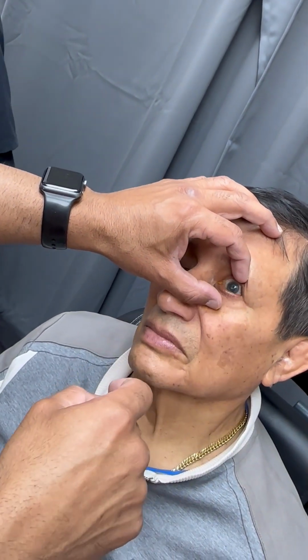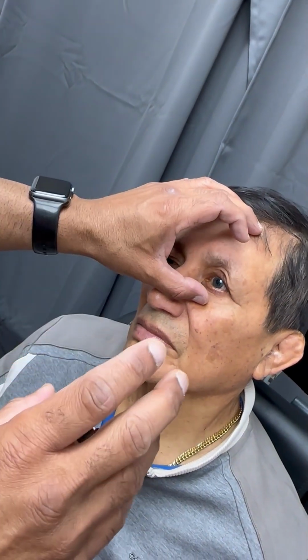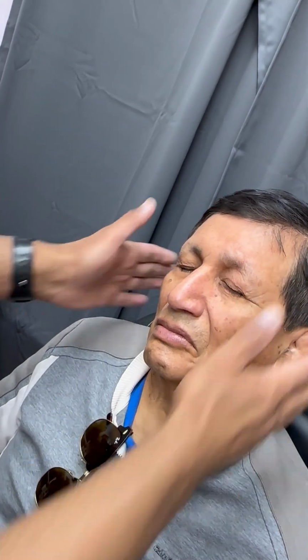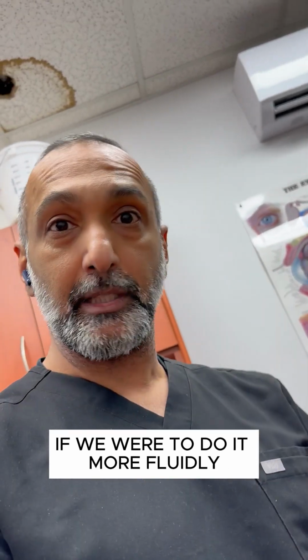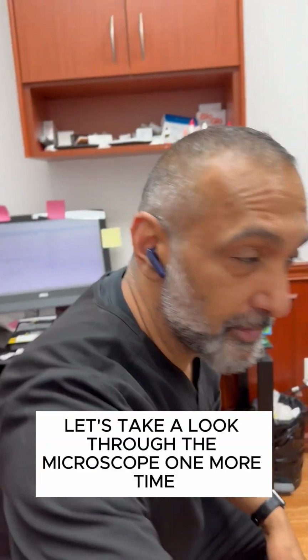Mira abajo el piso. Mira a mí. Good. Suavecito, cierre, abre. Mira aquí a mí. Good. Y cierre el ojo. Trata de cerrar el ojo. Déjalo cerrado. Good. Very easy, and that's with explaining and taking time and all that. If we were to do it more fluidly without this video component, probably 10 seconds to place. Very easy. Let's take a look through the microscope one more time and see what it looks like.